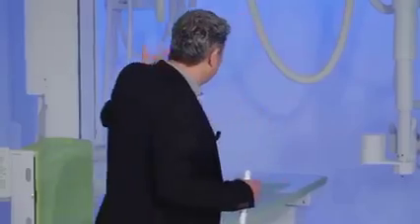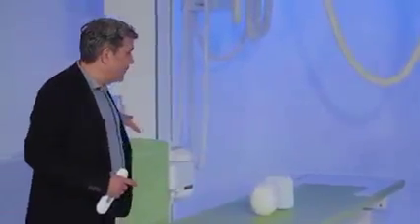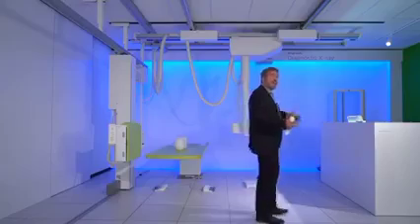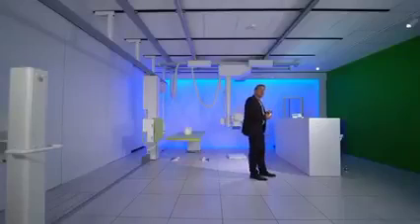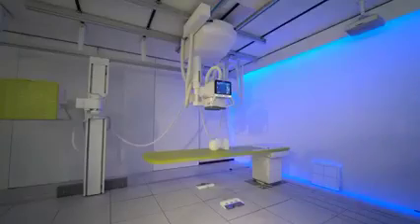Again, the Eleva tube head. Again, the unique concept of the flex room, the movable wall stand, SkyPlate detectors, all to make your examinations in a better way. But this is only one part of your examination and your examination room. Of course, you also have a control room. And what we have there and what the advantages are with our Eleva platform, I will show you right now.